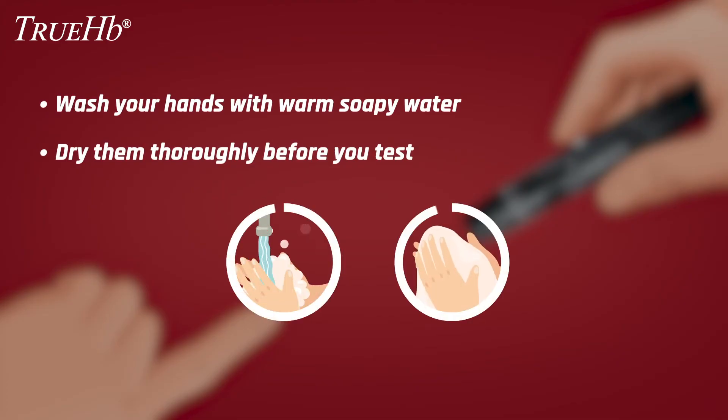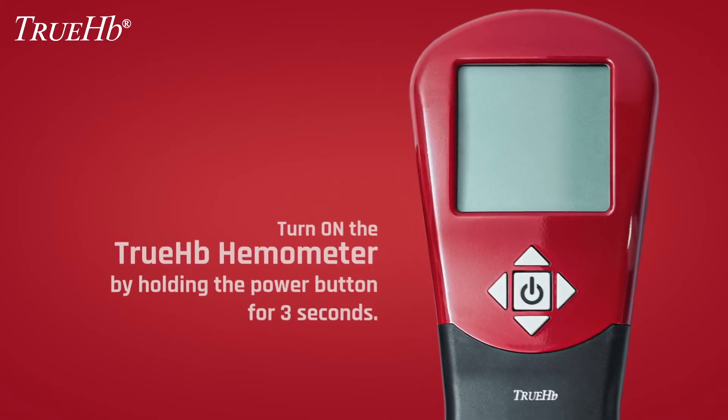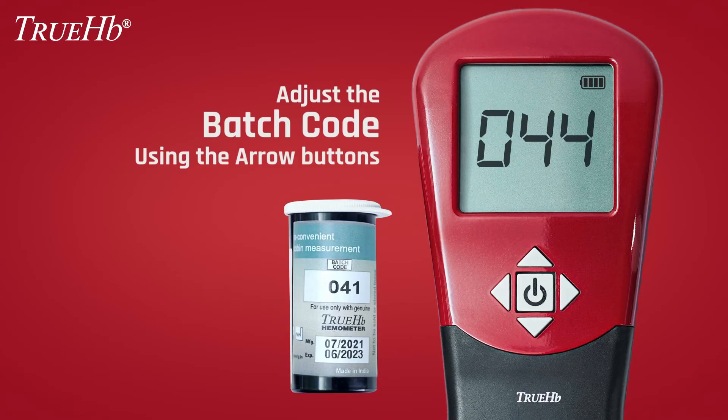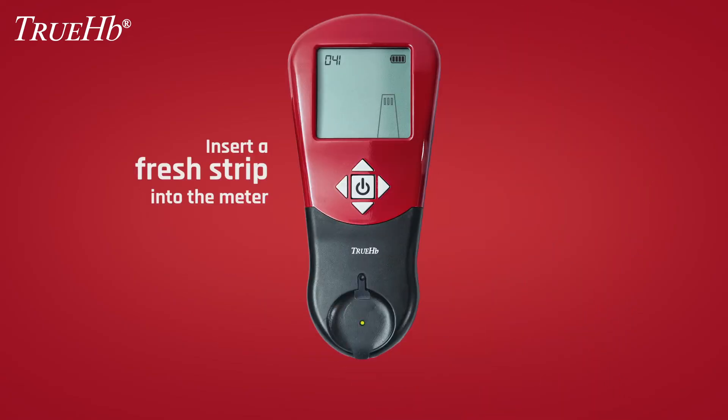Remember to always wash your hands with warm soapy water and dry them thoroughly before you test. Turn on the TrueHB hemometer by pressing the power button for 3 seconds, after which the battery level, strips, and batch code are displayed within 2 seconds. If the displayed batch code is different from the code on the strip bottle, use the left and right buttons to move to the desired digit, and use up and down buttons to set the correct value. Accept the batch code by pressing the power button to proceed. The TrueHB hemometer will then flash the strip symbol on the display.